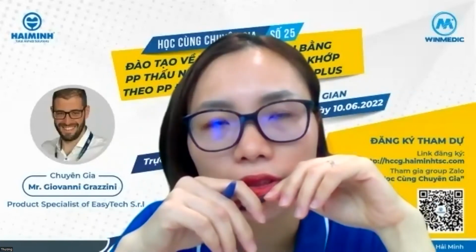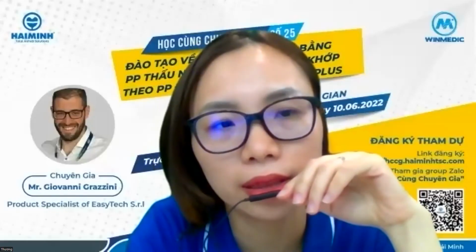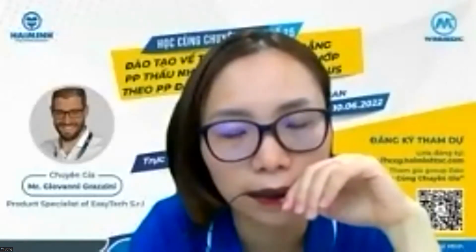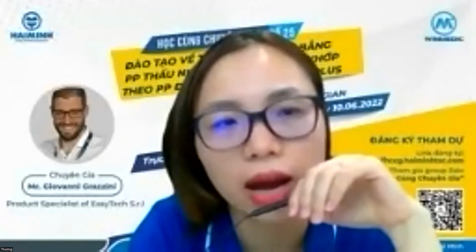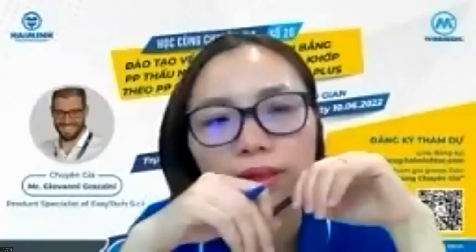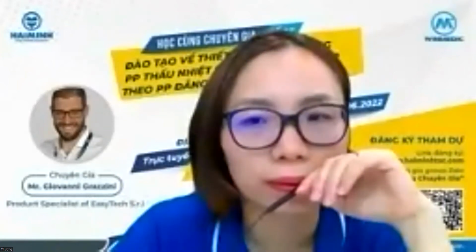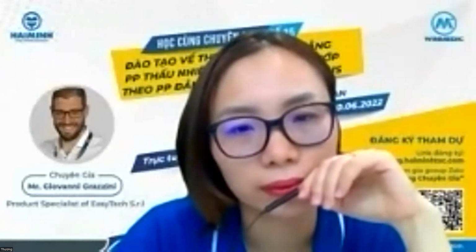Mrs. Lupi, if the patient has a metal part in his body, is it possible to use Nova? Okay, so there are some standard contraindications, of course, which are written in the user manual. You have to follow these standard indications. Consider that as manufacturers, we are strictly obliged to respect and stay within the main contraindications.